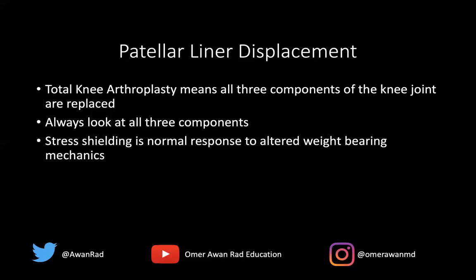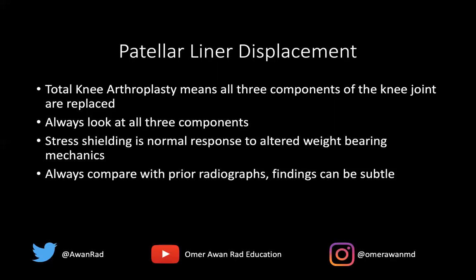Stress shielding is a normal response to altered weight-bearing mechanics and happens in other joints as well. For example, with a total hip arthroplasty, you'll often see radiolucency along the greater and lesser trochanter — a normal response to altered weight-bearing mechanics. You always want to compare with prior radiographs, because findings can be very subtle, especially subsidence or very subtle radiolucency. These things can be seen on serial radiographs, so always compare with a prior when looking at post-operative films.